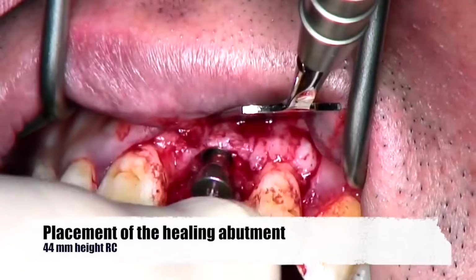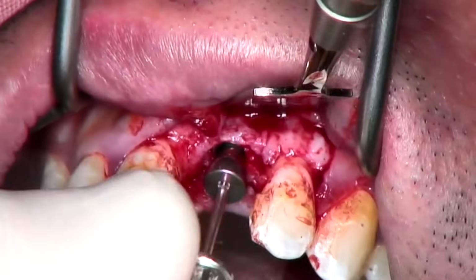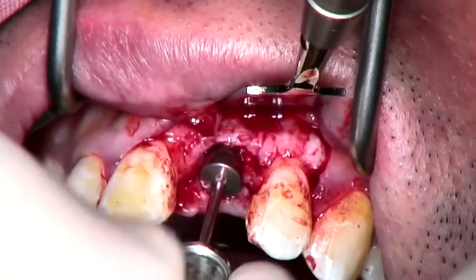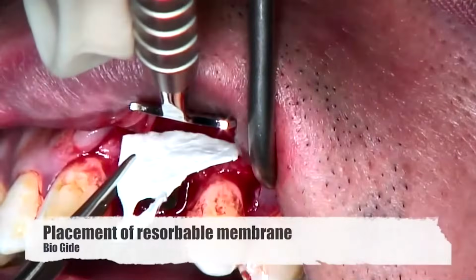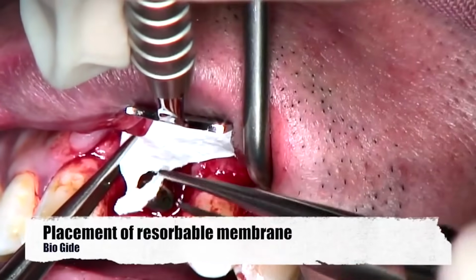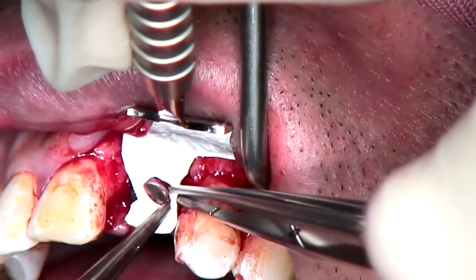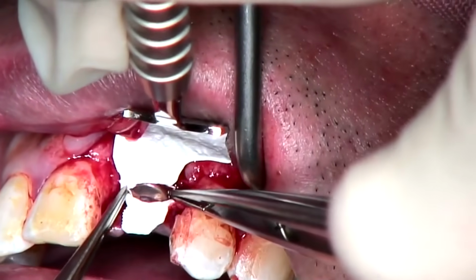A healing abutment is connected on top of the implant, as we will prepare the implant for transmucosal healing. A resorbable membrane is stabilized around the implant. The membrane is trimmed in order to completely cover the bone defect and is stabilized around the healing abutment.